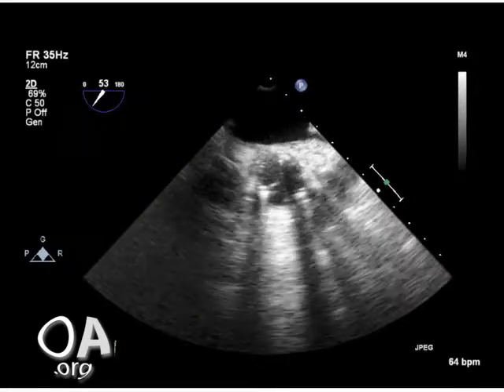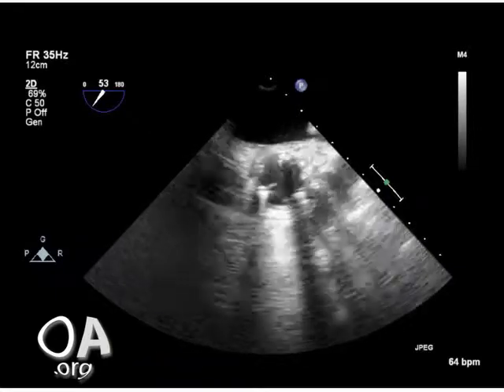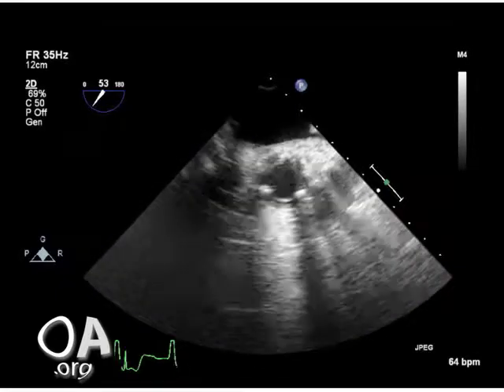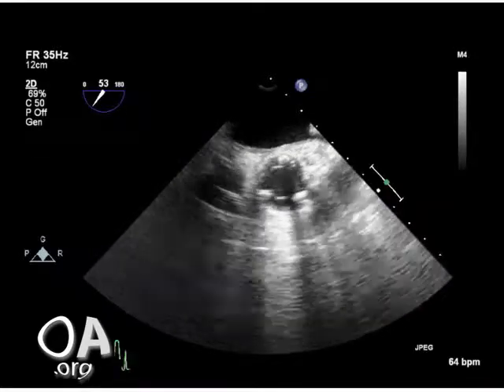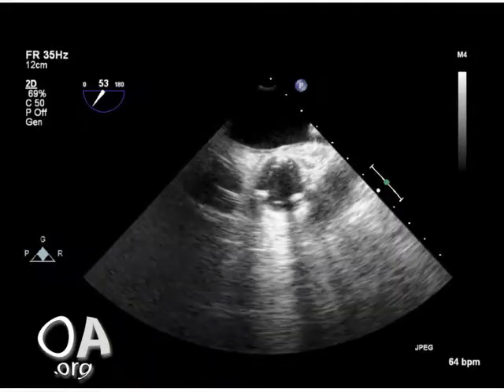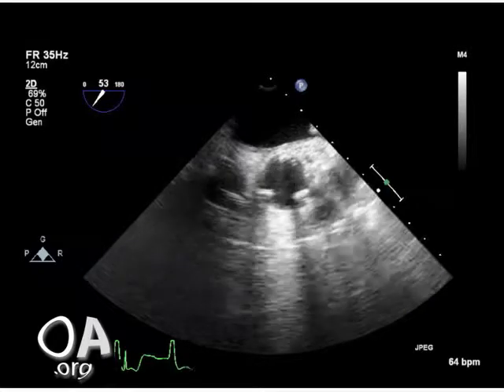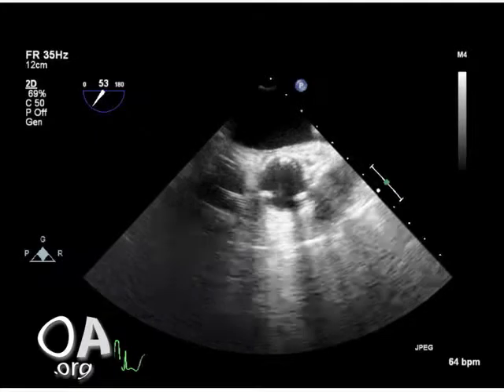This is a postoperative TEE image for our patient after his aortic valve replacement with his new aortic valve in cross-section, the mid-esophageal aortic valve short-axis view. The bright white appearance of the aortic valve circular ring and the prosthetic components are easily visualized. In addition, the shadowing and streaks radiating down into the far field of the TEE screen are artifacts due to the new valve.